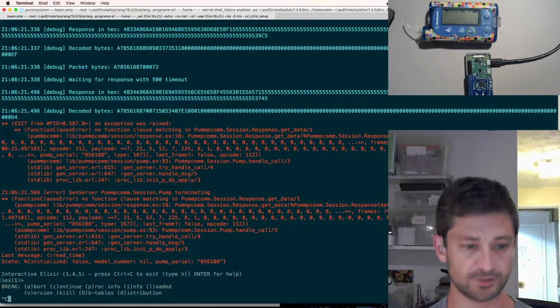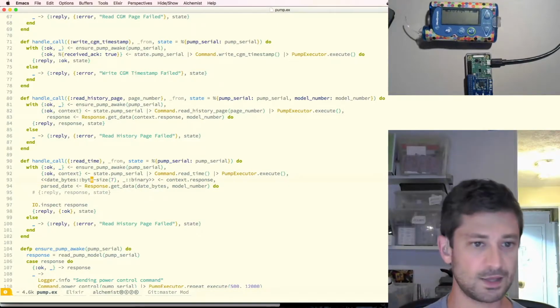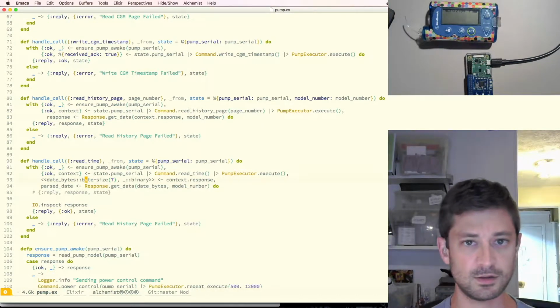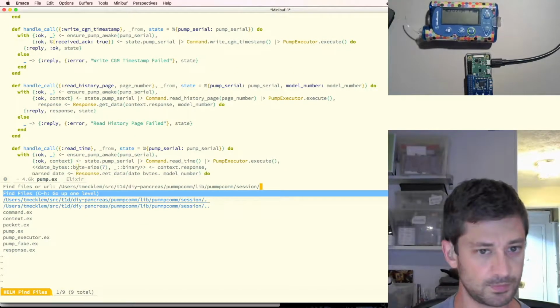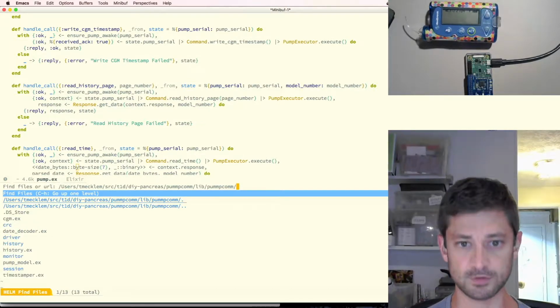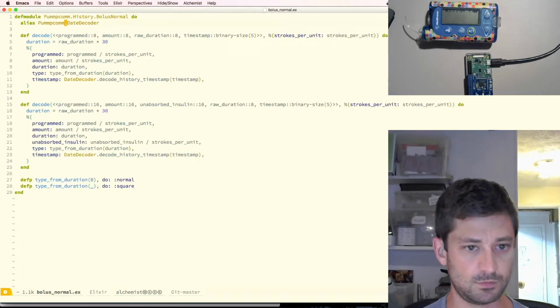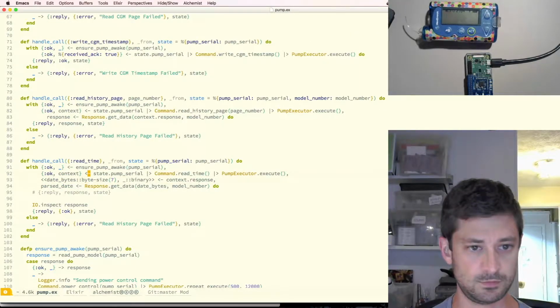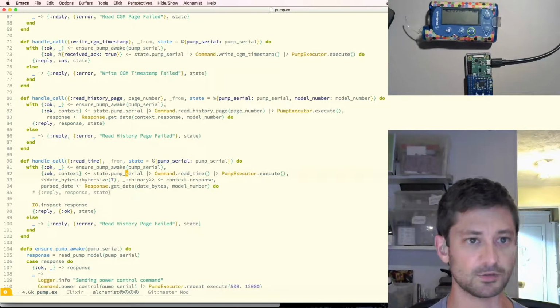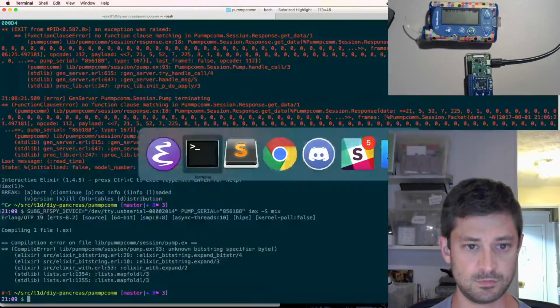All right, let's see what Elixir has to say about this. Yeah, I kind of wondered about that. I don't remember the syntax for parsing it back out and keeping it binary. I might have to go and code dive a little bit here. Binary size. Okay. Not byte size. That's more like candy bars and stuff. All right, try it again.